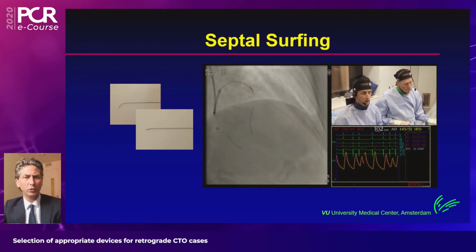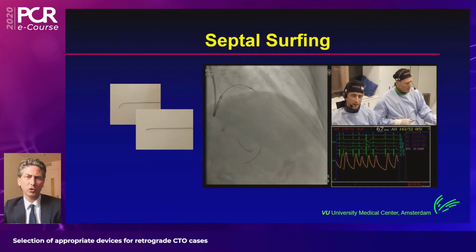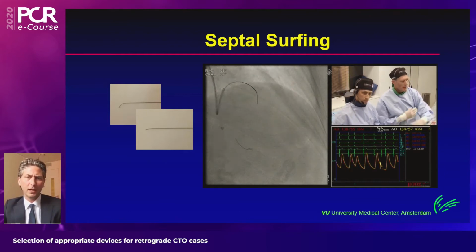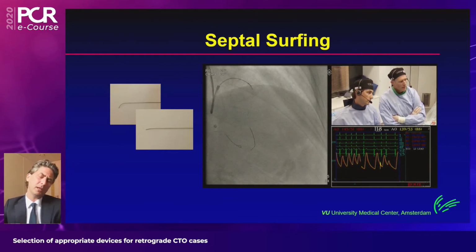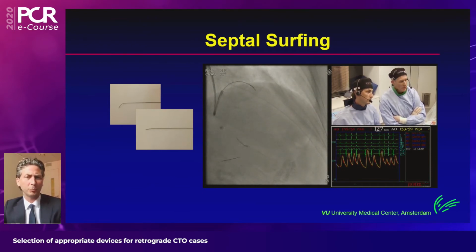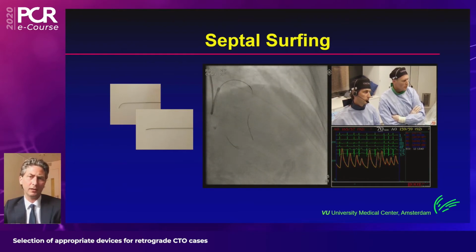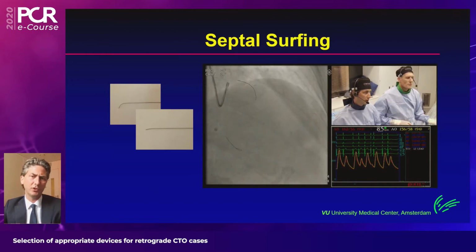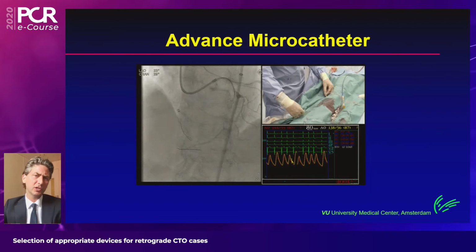And it goes to show you that even if you don't clearly see those septals, blind septal surfing can be a very safe maneuver to get yourself through the channel. And this was just the first run. It just goes to show you that you can go very fast through such a procedure if you choose the right materials and the right selection of the microcatheters and wires to get yourself through that septal. There's no rocket science behind it.